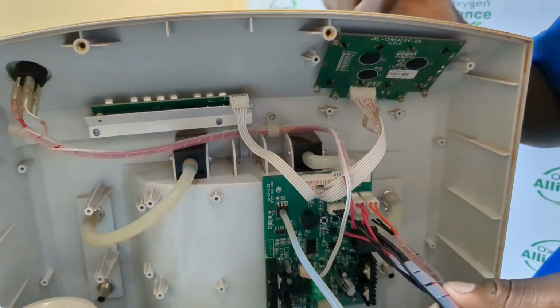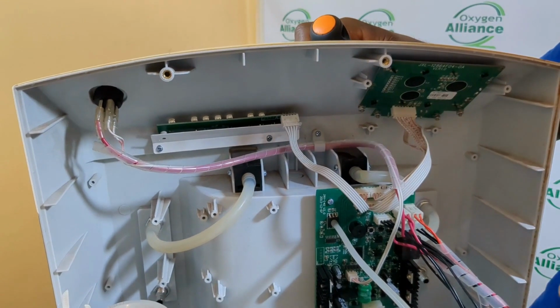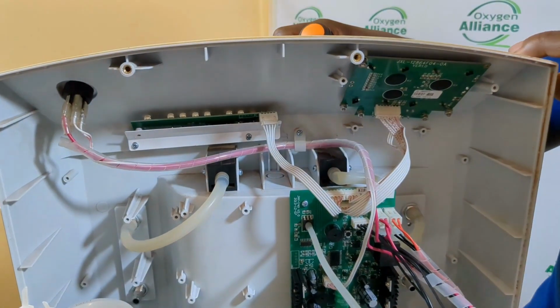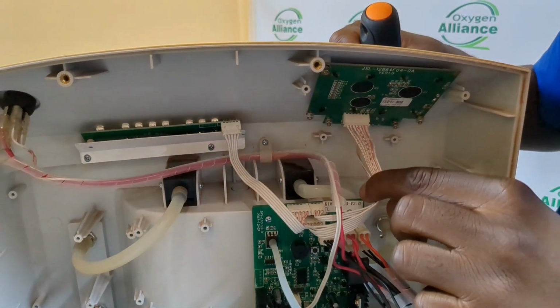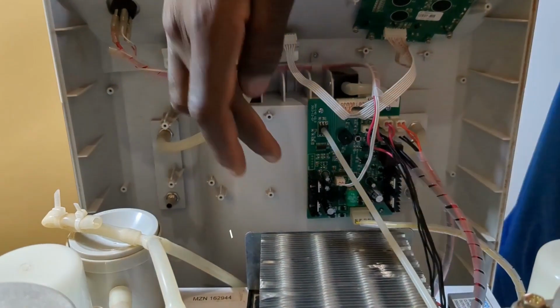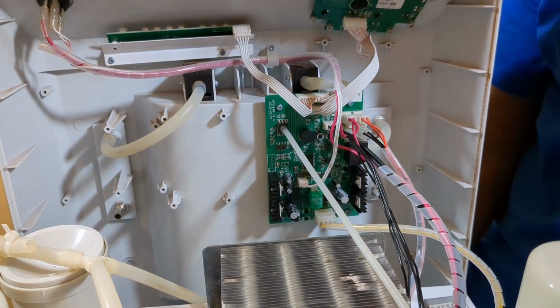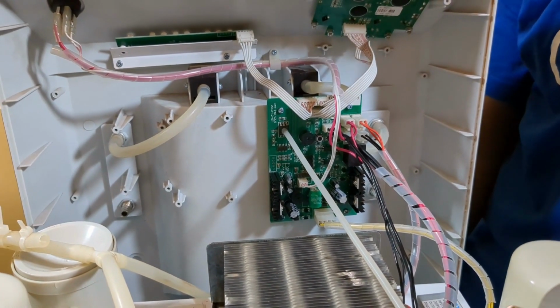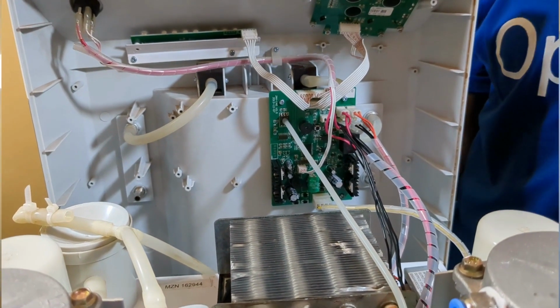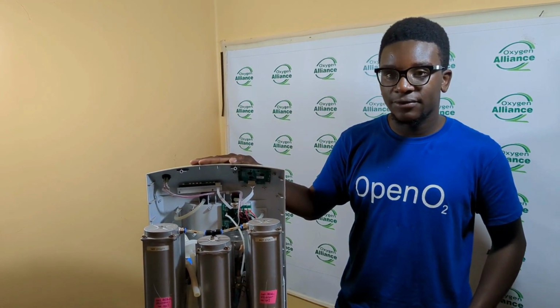The microcontroller also sends signals to the indicator LEDs to show the condition of the machine. It is also responsible for controlling the LCD through these two wire connectors. Moving on, we have these two buzzers here, and these are responsible for alerting the user if there is any complication in the oxygen concentrator, such as high pressure, low pressure, power failure, or low oxygen purity. So these are the main electrical connections on the J5 control board.